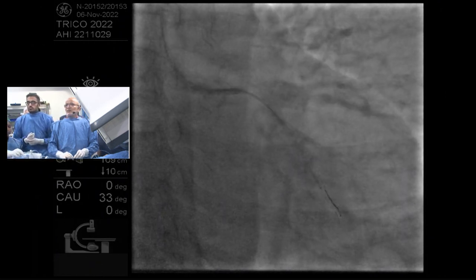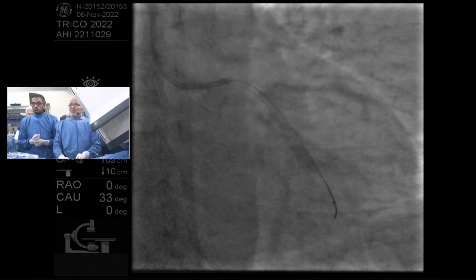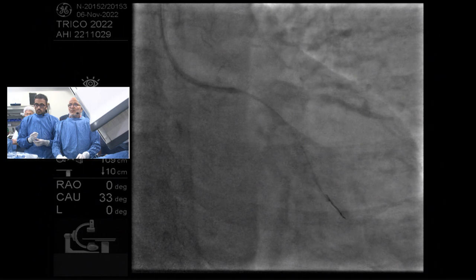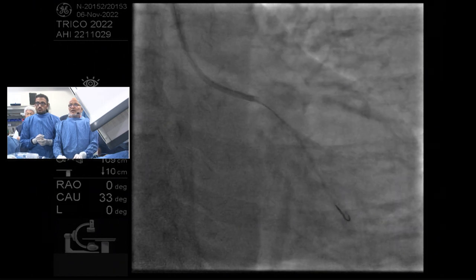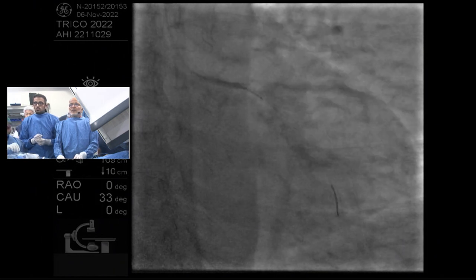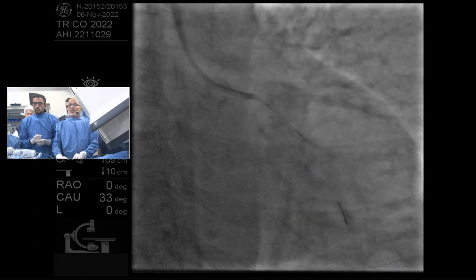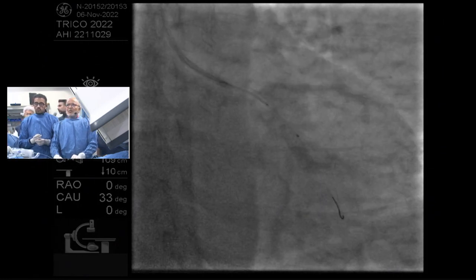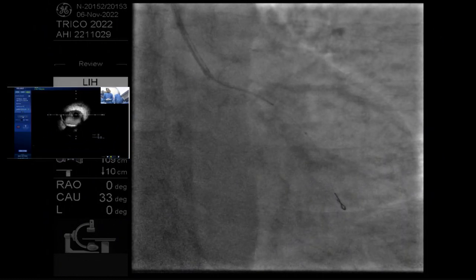That looks good. So just slow down though, right? It's because you need to create your landing zones here a little bit. So I would recommend doing one thing at a time, which is pulling this IVUS out of the circ and doing just the left main, because that's going to be your primary lesion. Okay. If you try to do both at the same time, you won't be able to co-register. So here you're fine. Back off your guide catheter. And let's turn the IVUS on to live, please. So you're live. Yeah, you're co-registration.